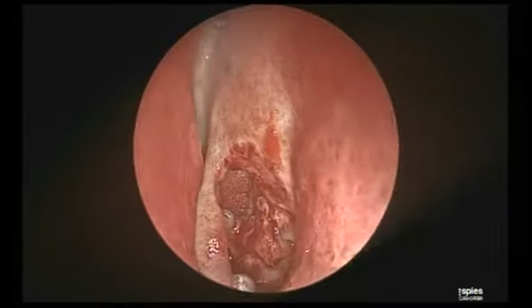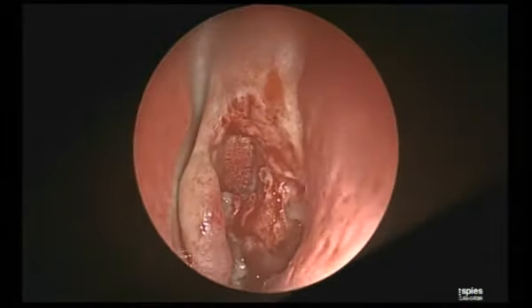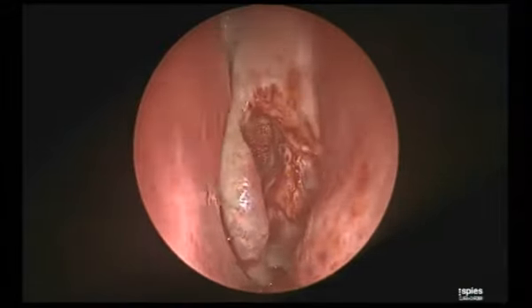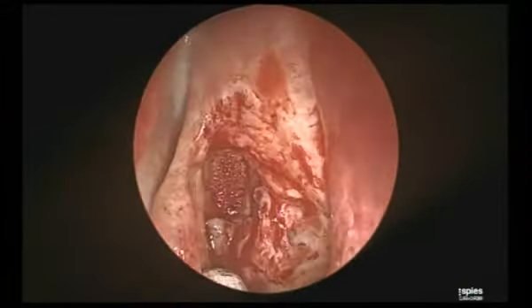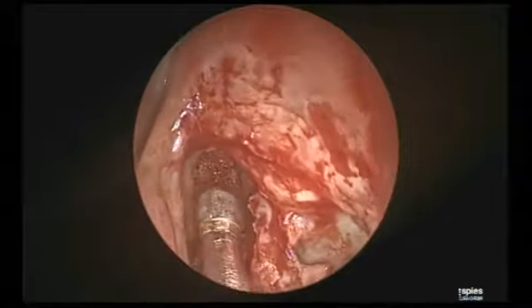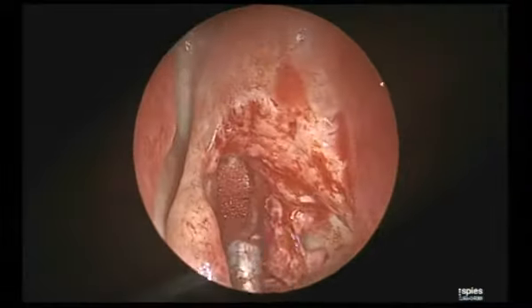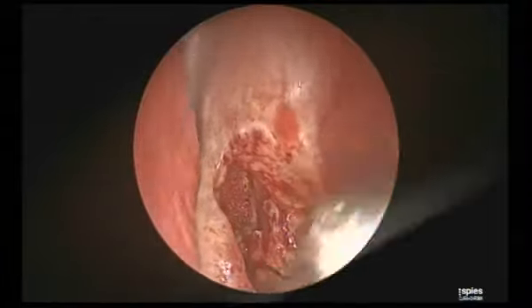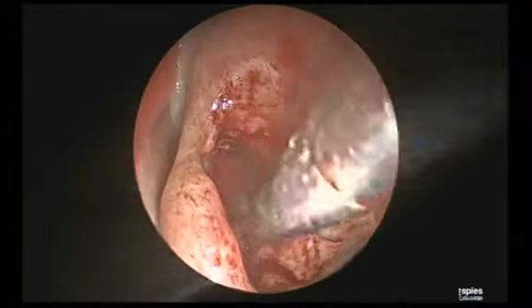Is there anything you've done to change the position of the head? Sometimes you may have to remove the flexion a little bit, but generally I don't do that. Rather than doing that, I use a 120 blade to work far anteriorly if I need to.